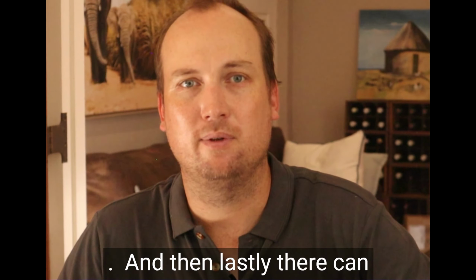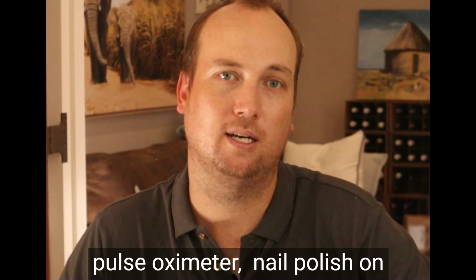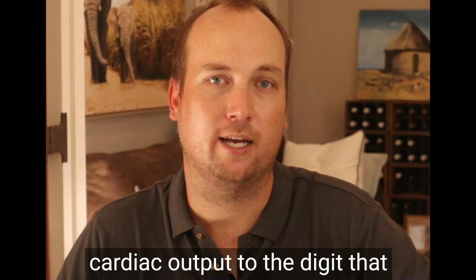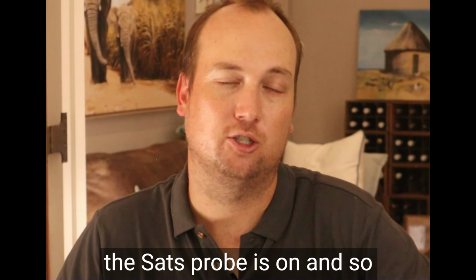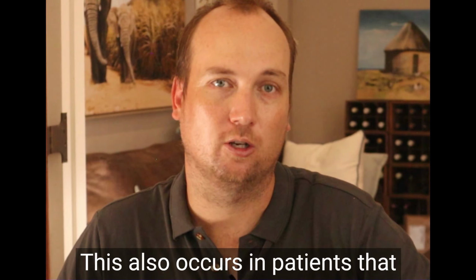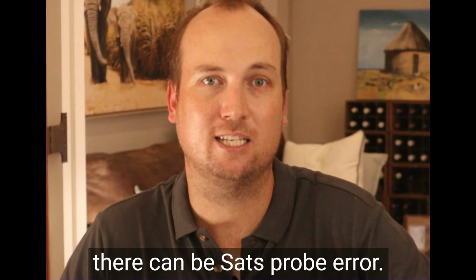And then lastly, there can be equipment issues. So there can be failure of the pulse oximeter or malpositioned pulse oximeter. Nail polish on the patient's fingers can affect the pulse oximeter reading. There could also be low cardiac output to the digit that the SATS probe is on, and so we could be picking up a low saturation because there is poor blood flow to the finger. This also occurs in patients that have got cold peripheries. Blood flow to the area is poor, and so there can be SATS probe error.